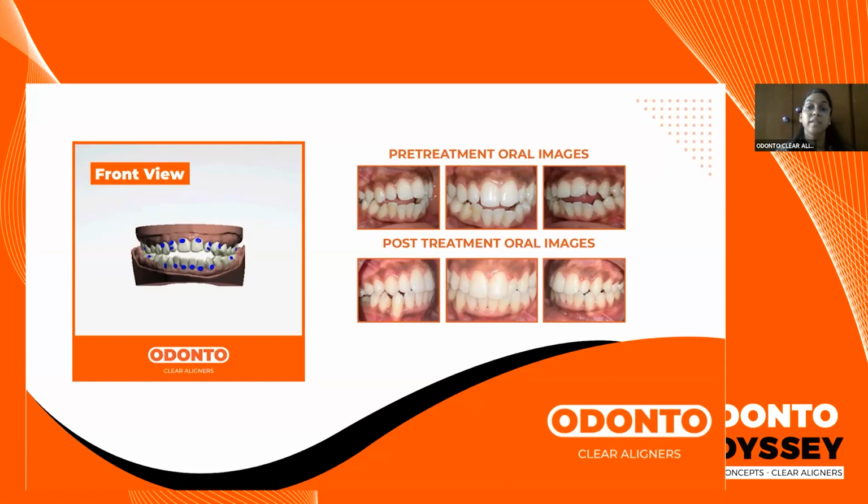So open bite cases are very favorable when you are considering aligners. So in your practice, if you have a patient with a dental open bite, then you can always go in for aligners as a treatment option, because the aligners themselves inherently have a force which will act on the posterior teeth and help in closing the bite, which is why the posterior bite will still be stable throughout the treatment. And as the intrusion takes place, the anterior bite will close. So it will have a synergistic effect on the tooth movement that you are trying to achieve.